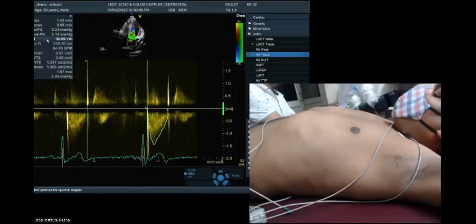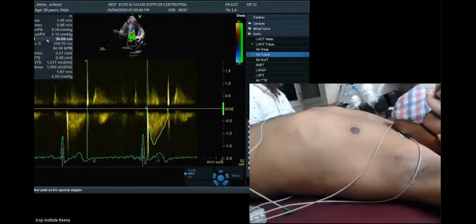Well, look, a number of times we have falsely elevated ejection fractions. I've said this before also. Suppose you have an apical infarct. If the apex is not contracting, what happens? The basal segments become hypercontractile as a compensatory mechanism, right? In that case, if I'm doing my M mode, it will be difficult, because you will find the M mode ejection fraction is normal when the patient definitely has a low ejection fraction.